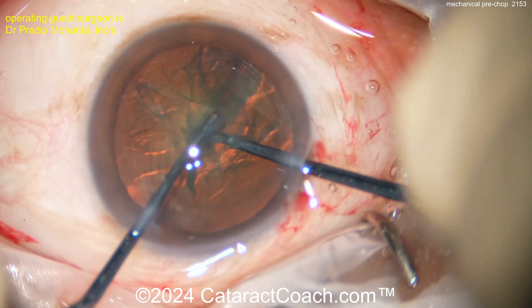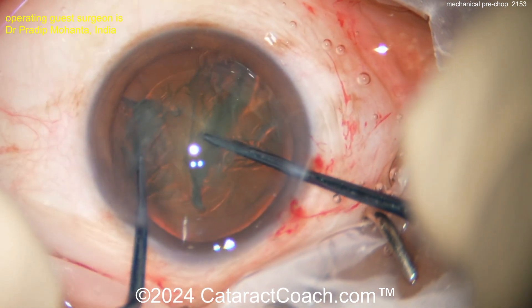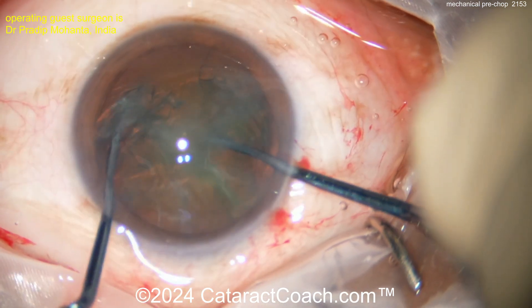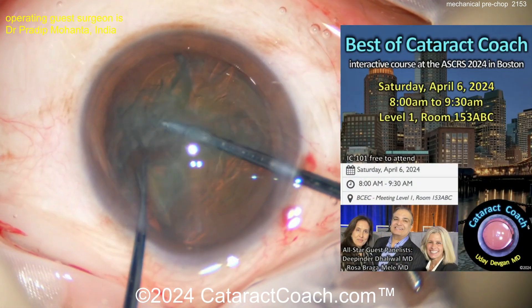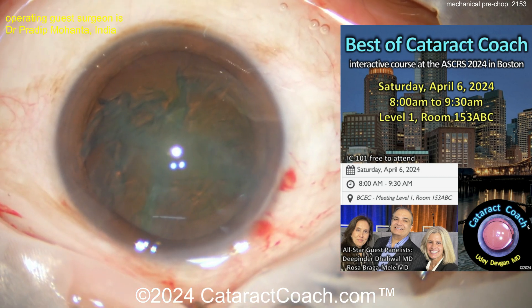Placing the chopper right at the hemi-nuclear edge, then bringing the sustainer in, bringing them together and splitting. Rotate again 180 degrees and the other hemi-nucleus can be split as well — beautiful four quadrants.